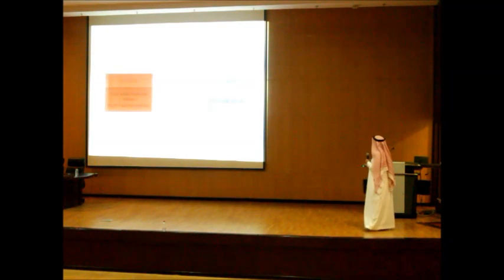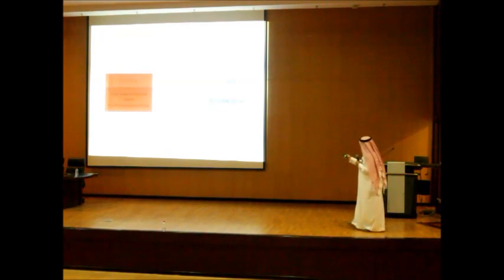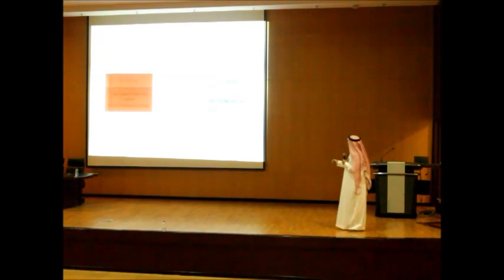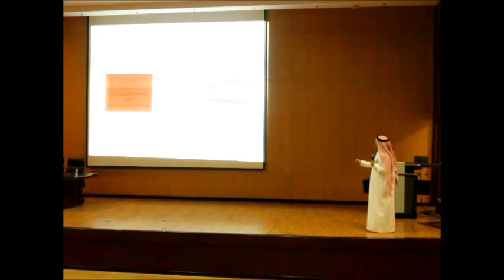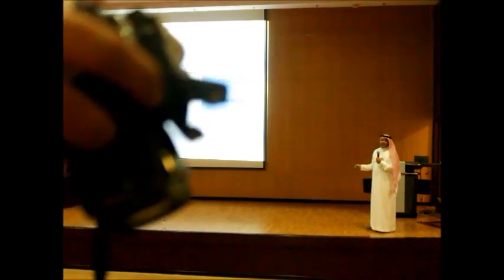Okay. So now we go to the intervals. The normal PR interval is 3 to 5 small squares. When you have a prolonged interval, more than 5 small squares, we call it AV node block. If it's shorter than 3 small squares, we call it pre-excitation.